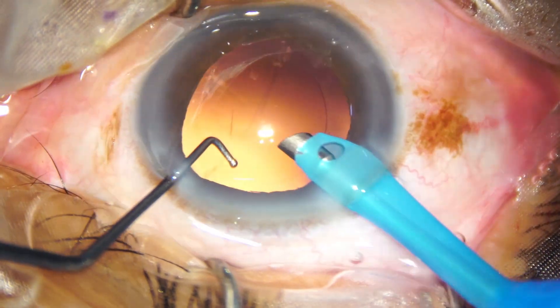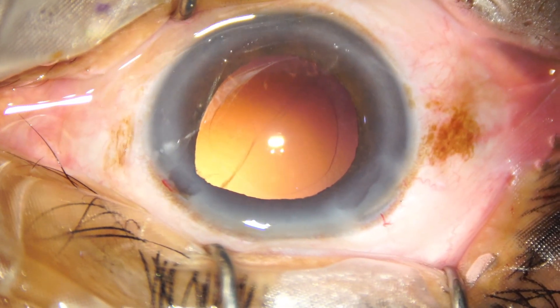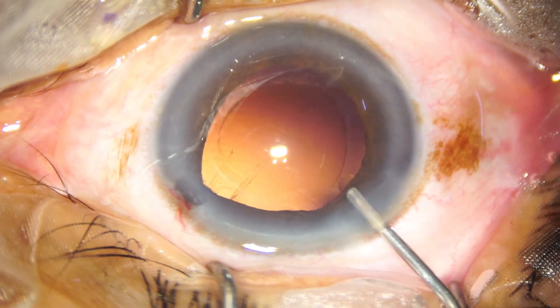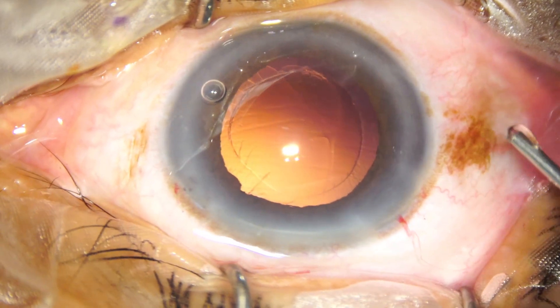So, the cortex is also removed by the handpiece. The iris is getting incarcerated in the wounds — both the main wound and the side wound — which means there is floppiness of the iris.